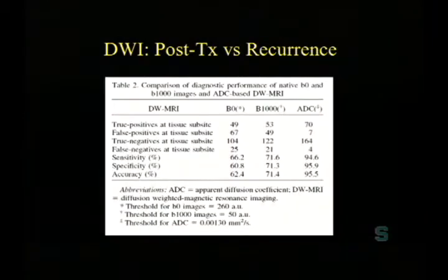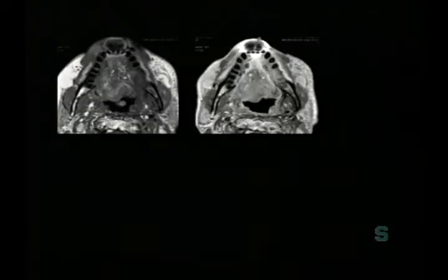So in his paper, what he showed was there was actually a 95% sensitivity for distinguishing recurrent tumor versus post-treatment changes. Now, I have to admit, over the last 10 years, and maybe Roberto can comment on it too, I haven't had that much luck. I haven't been able to achieve it. Have you been able to achieve 90 or 94? No, 99. It's a very, very high bar. Unfortunately, we haven't been able to replicate this. But having said that, it is beneficial.